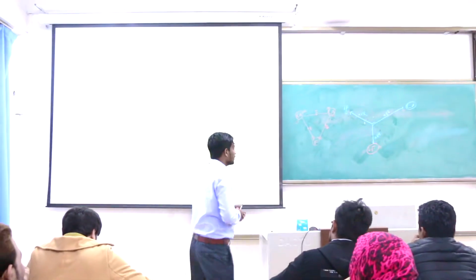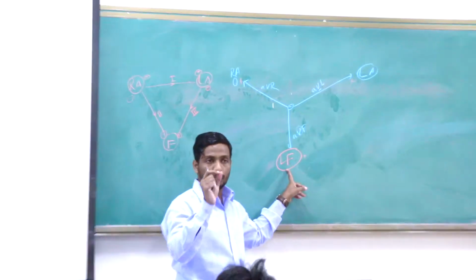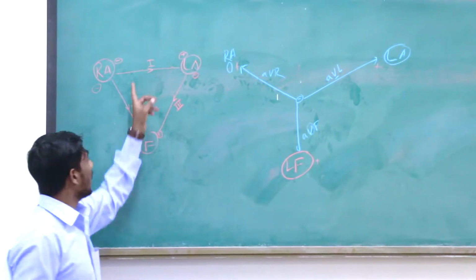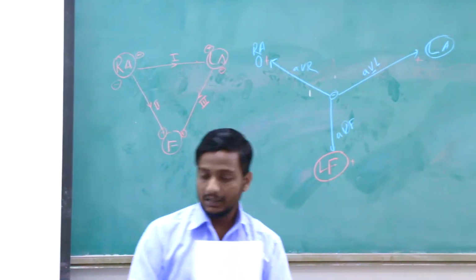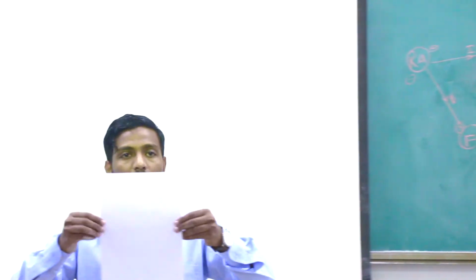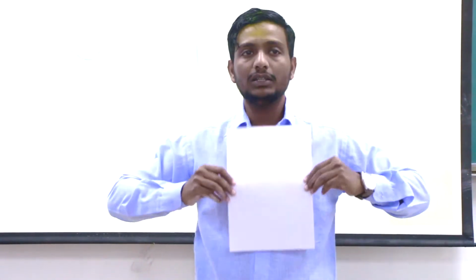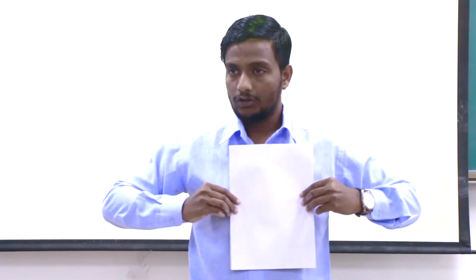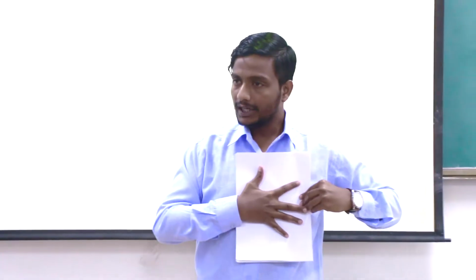When they work alone, they produce the unipolar leads. We call them aVR, aVL, aVF, and when they work in a group, they are bipolar, and we call them lead 1, 2, and 3. And the thing for you people to remember here is that these limb electrodes are going to look at our heart in this plane, right? Not in this plane. They are going to look at our heart in the frontal plane. Are you getting the idea?